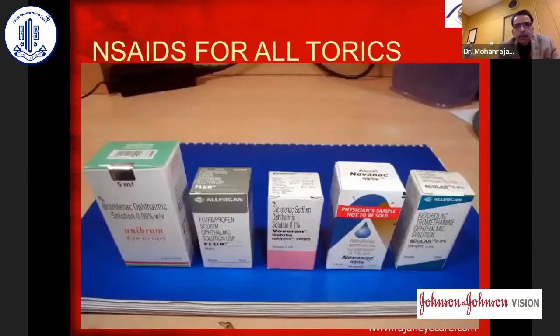So what I do is I use NSAIDs for all toric patients, and also use very good viscoelastics like Viscoat or Discovisc, and also power modulation, like a cold phaco technique, to make sure that the cornea is clear irrespective of the density of the cataract.